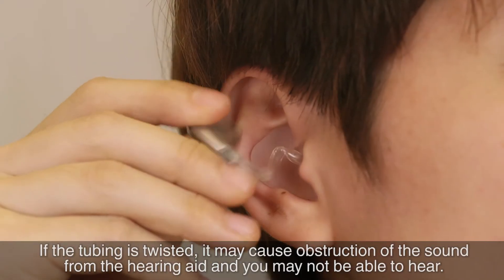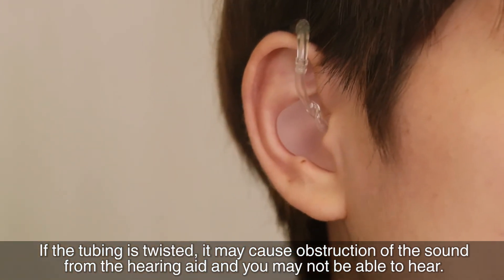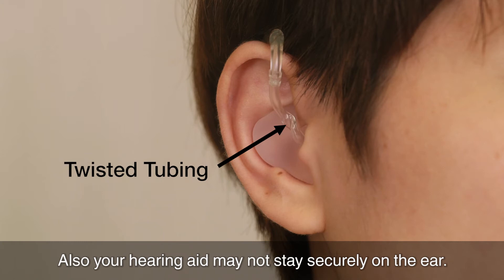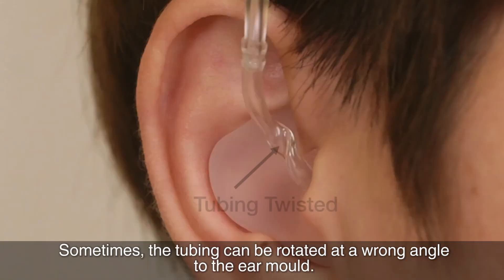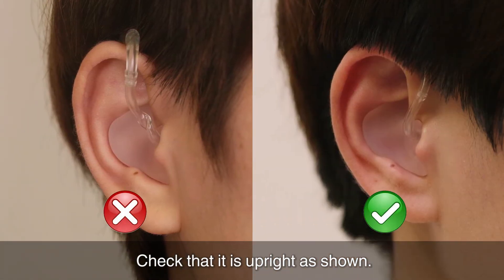If the tubing is twisted, it may cause obstruction of the sound from the hearing aid and you may not be able to hear. Also, your hearing aid may not stay securely on the ear. Sometimes the tubing can be rotated at a wrong angle to the ear mould. Check that it is upright as shown.